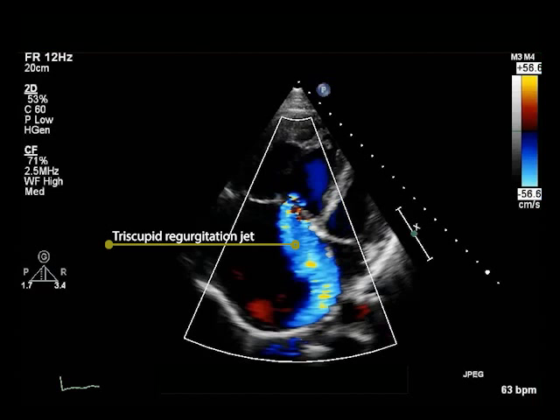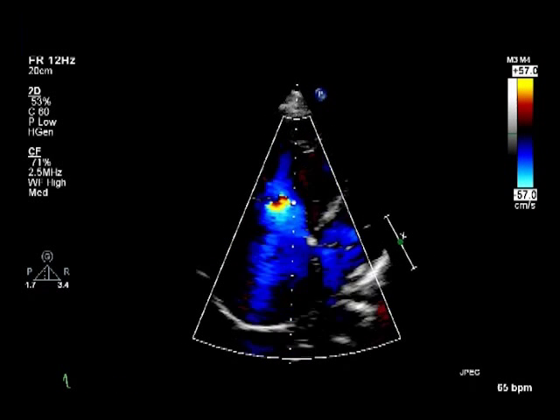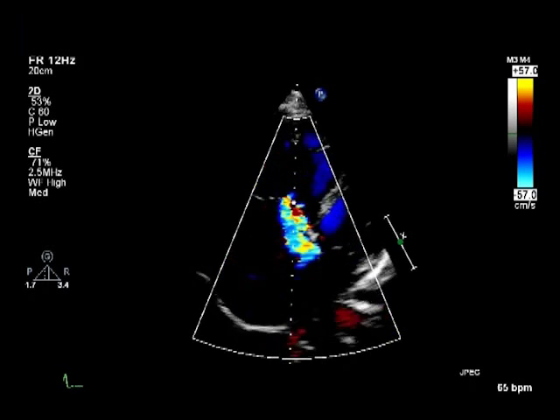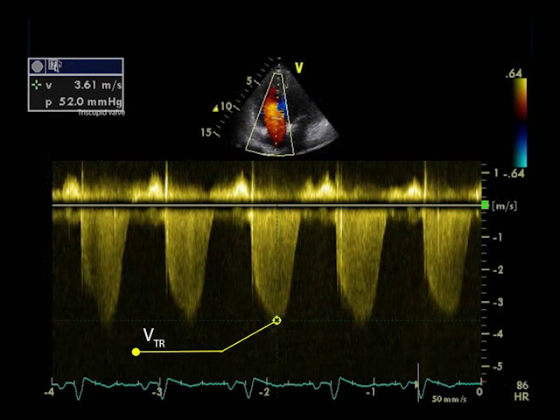Peak tricuspid regurgitant velocity is measured in the apical four-chamber view, and it is derived from the application of continuous wave Doppler across the tricuspid regurgitant jet. The measurement of the peak tricuspid regurgitant velocity is shown here.